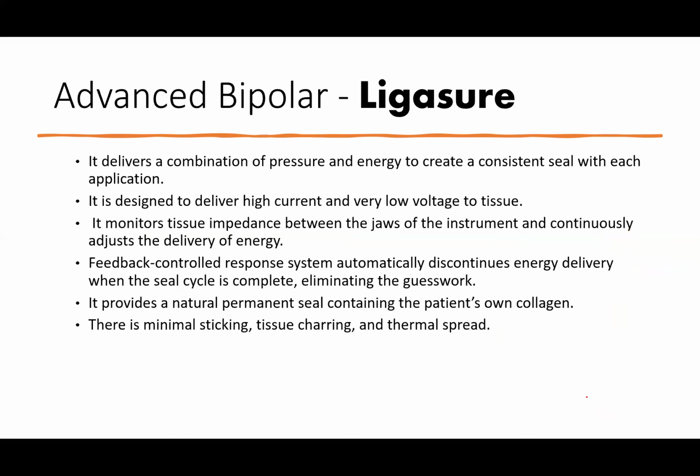So we just talked about the conventional monopolar and bipolar instruments we all know, the diathermy machine. The difference in use with laparoscopic surgery is just the handpiece, which we've seen. For the monopolar, you use the L hook or you attach the cable to any of the instruments and it becomes a monopolar instrument. But for bipolar, you have a specific handheld bipolar forceps that you attach.